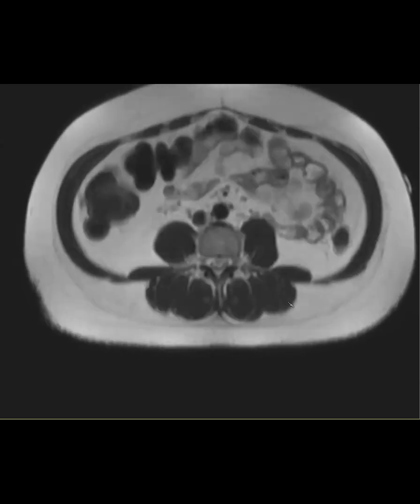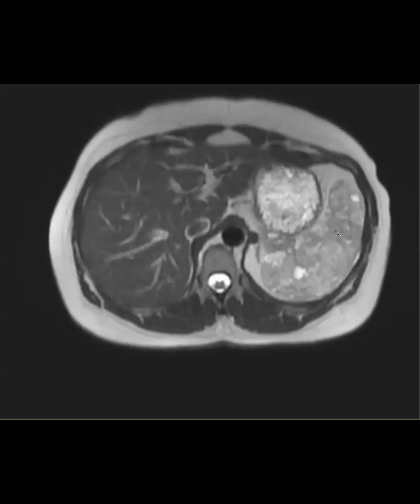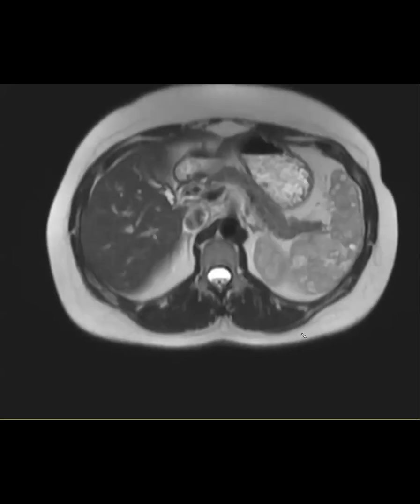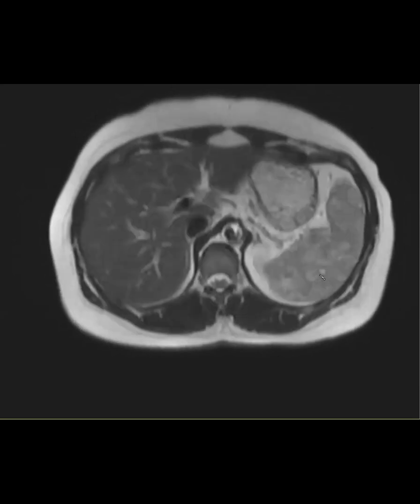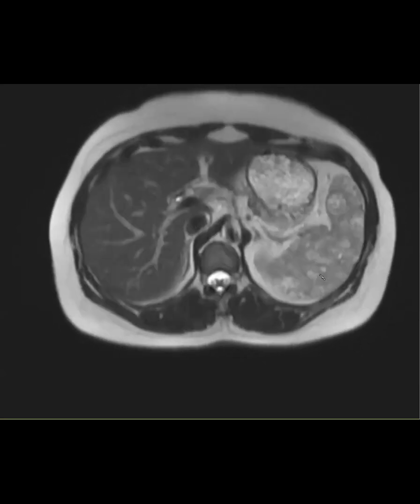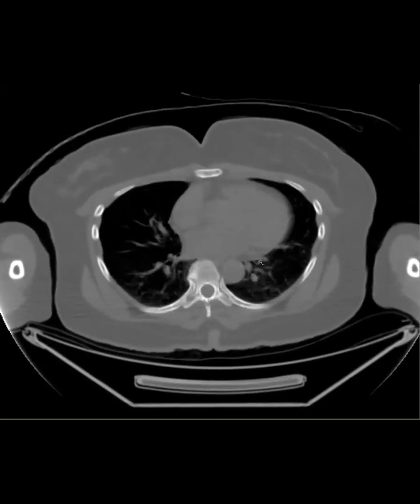Didn't really see much else in the abdomen. There weren't other lymph nodes or anything like that. So we were kind of concerned, like this doesn't look like just a bunch of benign lesions. It didn't really look like littoral cell angioma, which tends to be more hypoenhancing lesions. So we brought up lymphoma, metastatic disease, and asked them to consider a biopsy. But the patient ended up getting a PET scan, which was interesting.